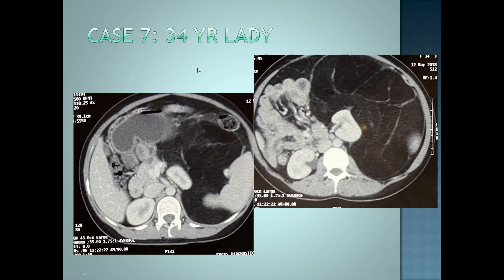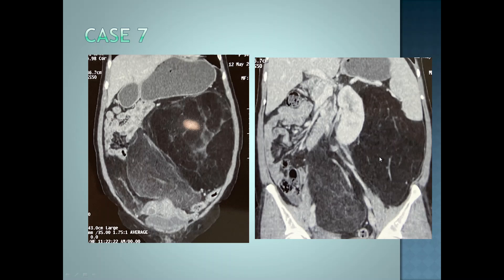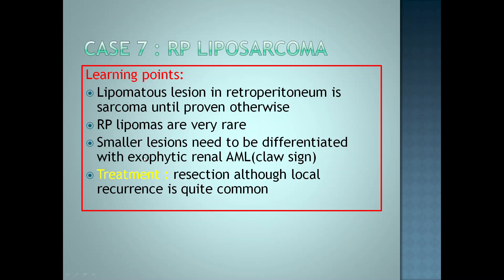Seventh case — 34-year-old lady. The abnormality is in the left retroperitoneum. There is mass effect on the kidney; it is pushed anteriorly, which indicates this lesion is retroperitoneal. The colon is displaced anteriorly. This mass is predominantly fat density with few strands of soft tissue density. Coronal CT shows the extent of the lesion better. This is a retroperitoneal liposarcoma. Any lipomatous lesion in the retroperitoneum is a sarcoma until proven otherwise, as retroperitoneal lipomas are very rare. Smaller lesions need to be differentiated from exophytic renal angiomyolipomas using the claw sign or focal renal defect. Treatment is resection, although local recurrence is quite common.